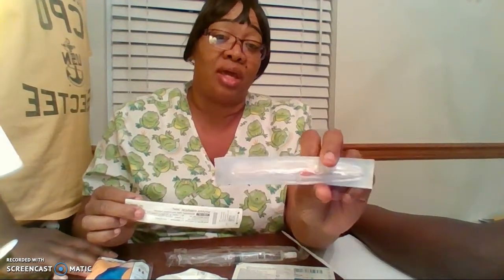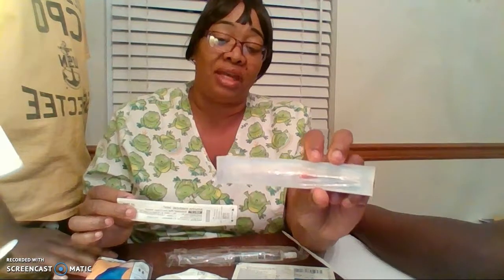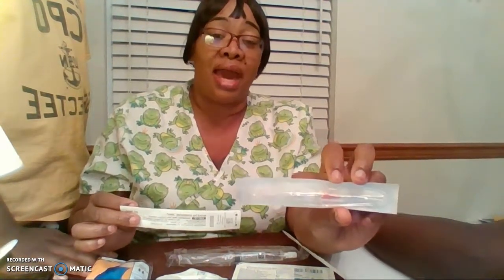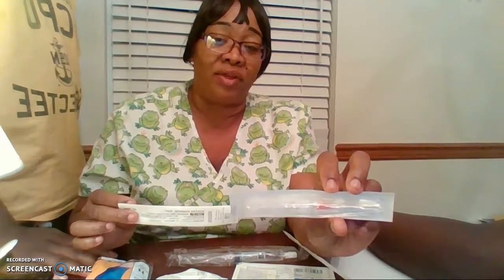And these needles have no connection to them, so once you use this kind of needle to access a vein, you must then immediately either lock it with a cap on the end and maintain the patency of it without having the patient bleed out, or you want to immediately attach some IV fluids and go ahead and run that line and/or medicate the patient with the line before, during, or after the process.